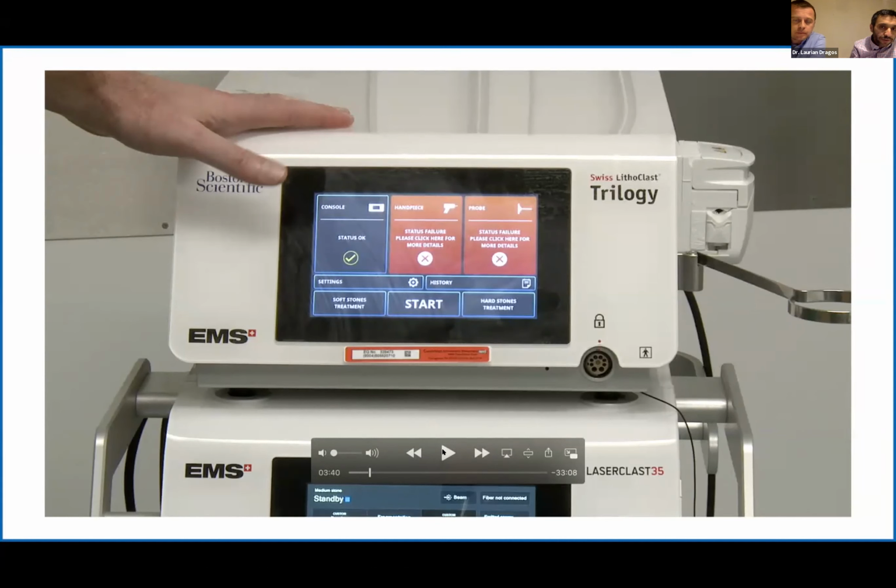It's also a very versatile device. In addition to just being held like a gun, it allows you to control all the energy sources, i.e. the ultrasound and the ballistic, separately, and set the levels to what you require, in addition to altering the suction level. Again, hopefully you'll see during the procedure where we have played around with the energy levels, including the suction, to get the optimum setting to clear the stones. So it really does make a big difference.